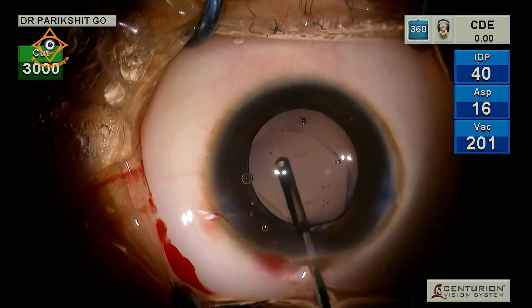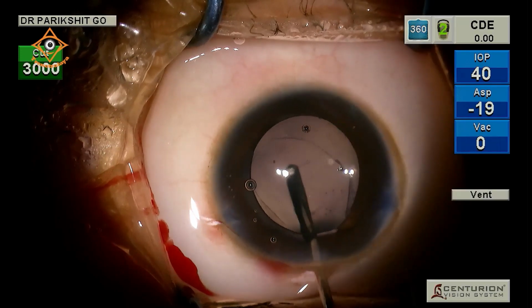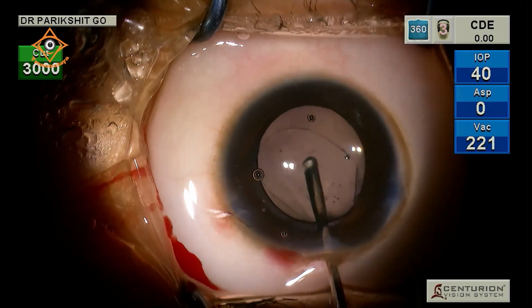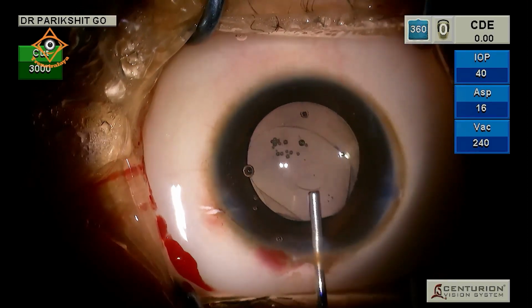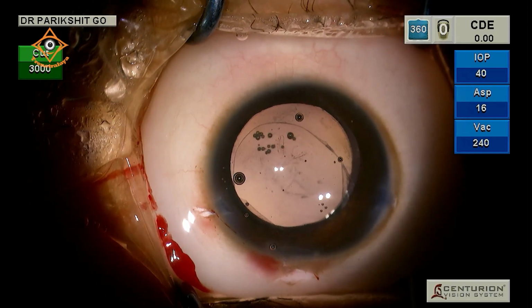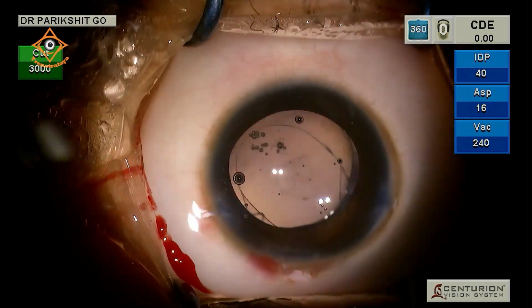Excellent. So for at least 5-6 years, we would do it through the pars plana, which makes it actually easier, because then the main port and the main incision and the anterior chamber are not at all disturbed. And as we always say, when we do a vitrectomy, there is this beautiful video of that wool being pulled out, and if you do it from behind, it goes behind. But well, as anterior segment surgeons, going through the pars plana is a bit time consuming. So I think it's more of laziness, or just because you have too many things to do, you do it through the anterior.